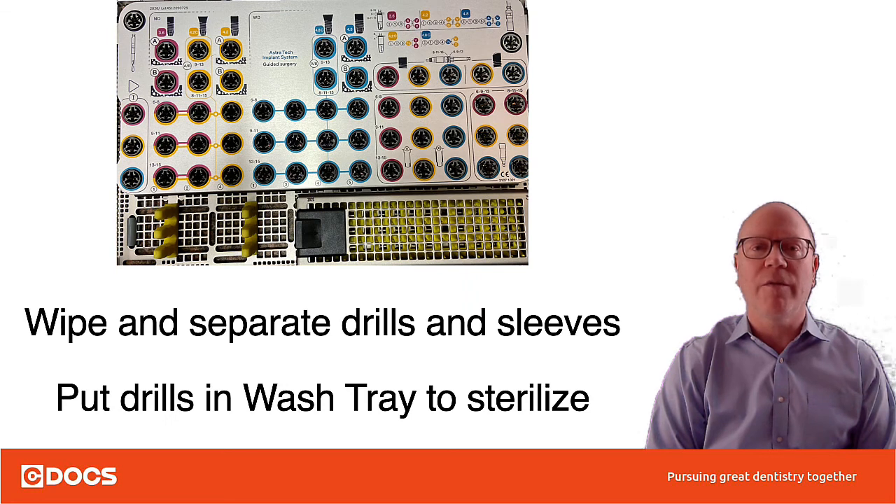As a review: wash and separate your tips from your sleeves and from the drills, then put your drills in the wash tray to sterilize. Thanks, I hope you enjoyed this video and we'll see you on C-Docs.